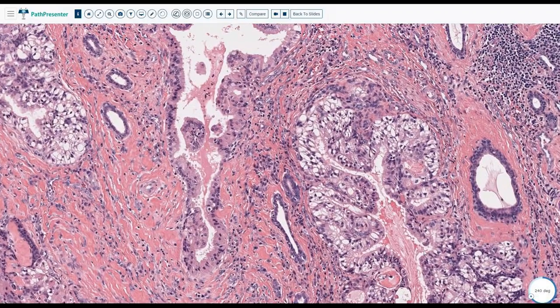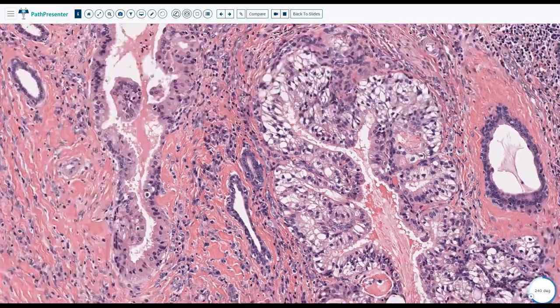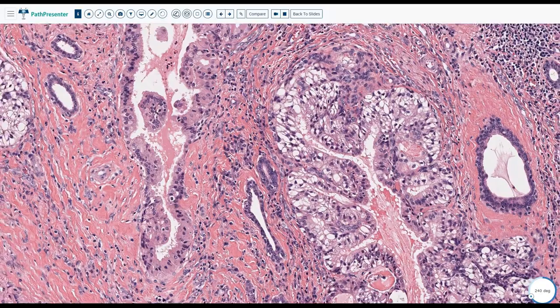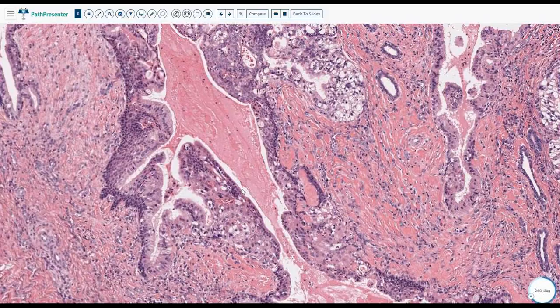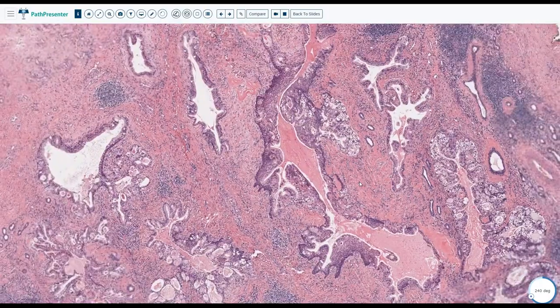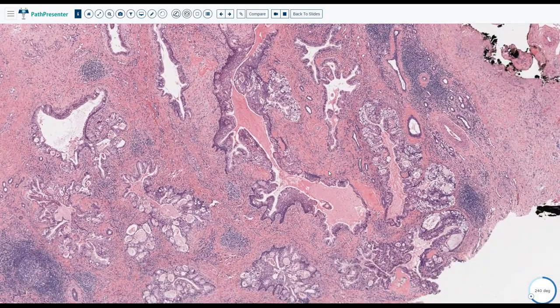Probably they are just squamous or epidermoid cells at different stages. But anyhow, they call them epidermoid cells, and we have squamous, we have mucocyte, and we have these intermediate cells. Okay, I agree with you guys. This is the mucoepidermoid carcinoma.